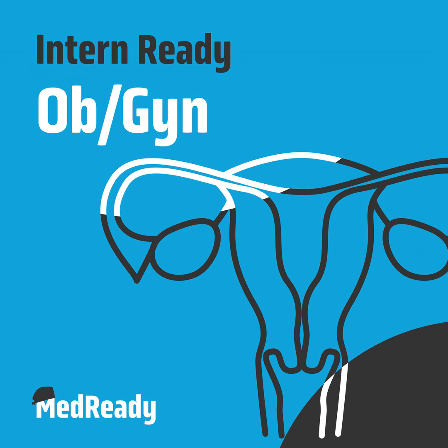Yeah, I think that's a really good tip. Otherwise, of course, anytime we're doing any kind of instrumentation in the uterus, we think about our concern for hemorrhage and the risk of that. It's less common in a diagnostic hysteroscopy, but in an operative hysteroscopy, especially when you're going after something like a submucosal fibroid, it can be in up to 3% of cases. You think about what you do for hemorrhage in a postpartum delivery, kind of the same things. You try uterine massage, you try uterotonics, and then if it's really severe and it needs some kind of tamponade, you can place things like an intrauterine balloon.